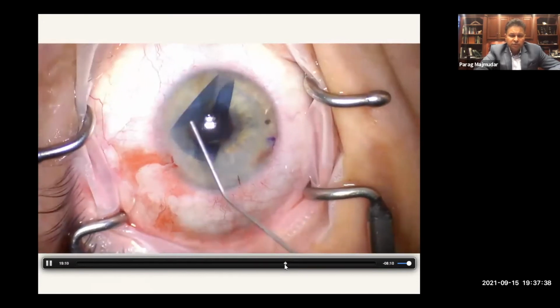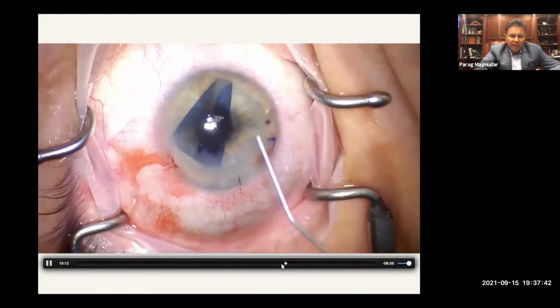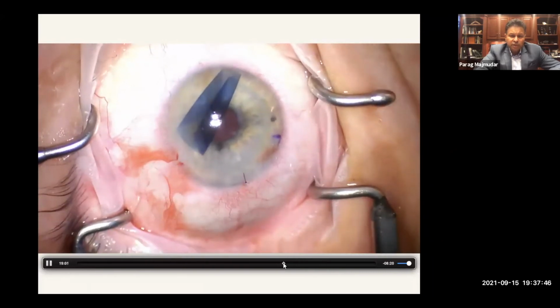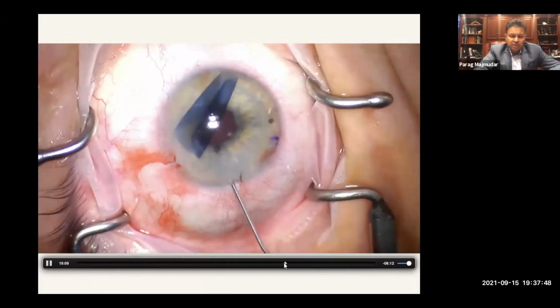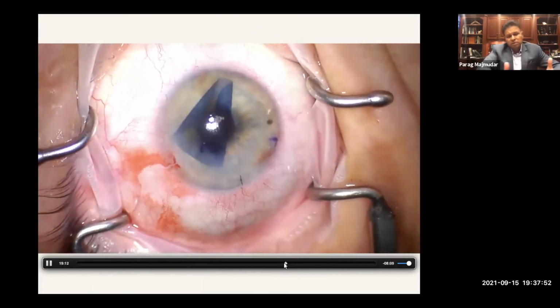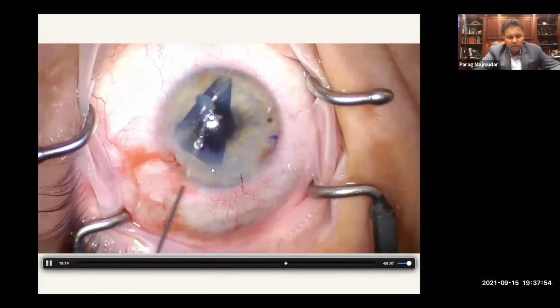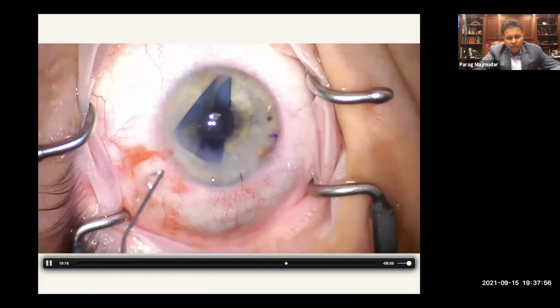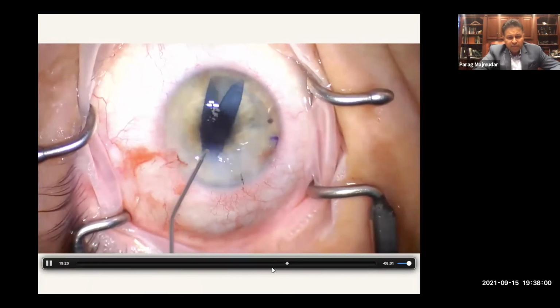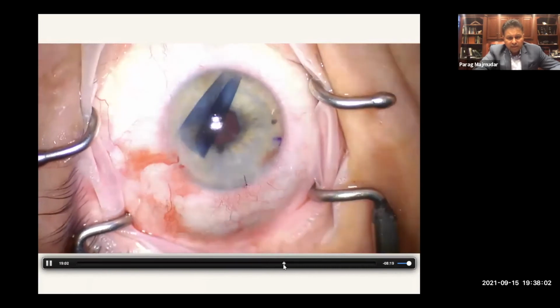And so we're using different maneuvers. We're using a little bit of flattening of the anterior chamber. Again, I'm releasing a little bit of fluid through the main incision right here. And as I'm flattening the chamber, the graft wants to automatically already unfold. Now, I'm making sure that my S stamp is right side up. And as you can clearly tell, it is not, right?